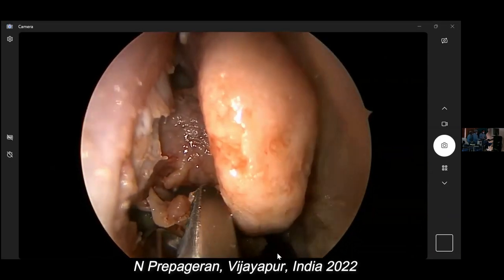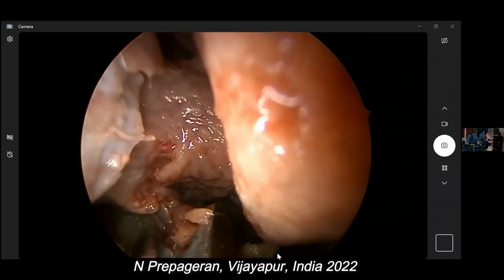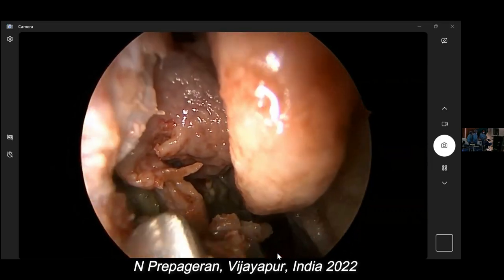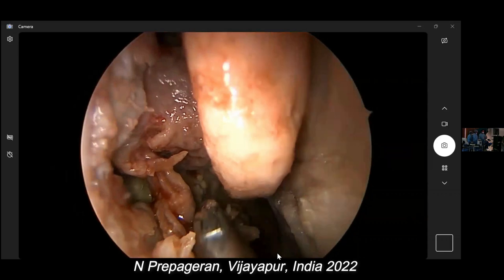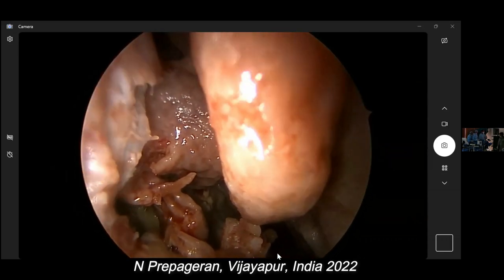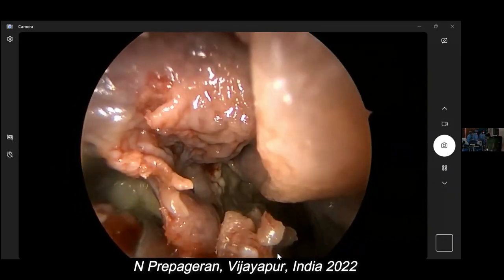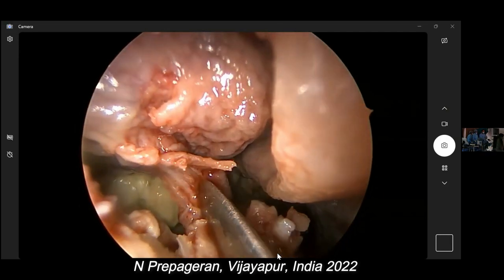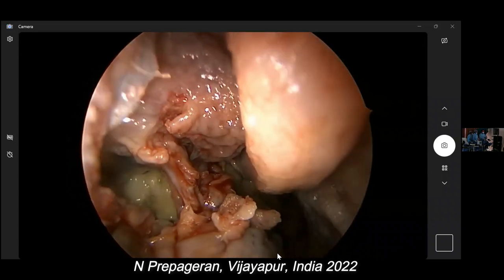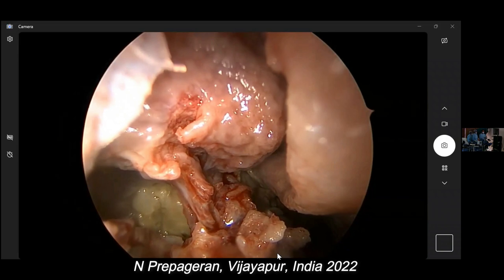So that is the uncinate tail. Very, very important. Only if you have removed the uncinate tail, you have a view of the maxilla. Can you see? So that's gate number one. If you want to enlarge the maxilla, all you have to do is dissect lower like this and flip it open. What you don't want to do is to destroy the mucociliary clearance. This is more than enough. Okay, this is gate number one.